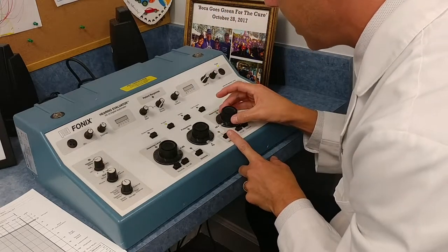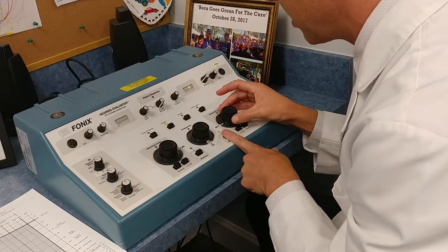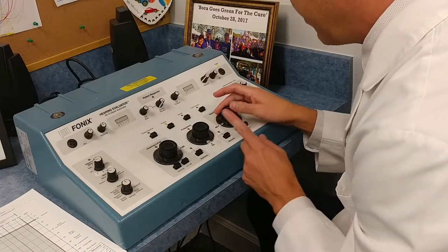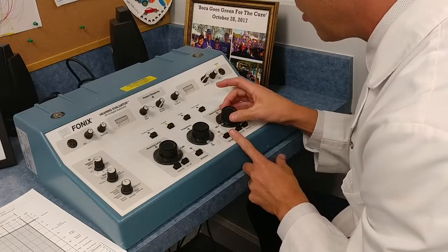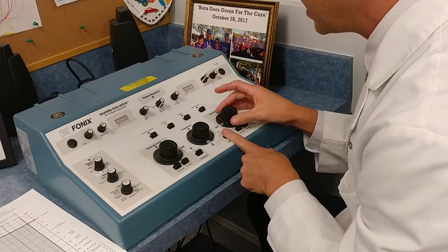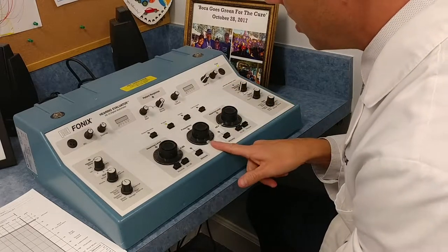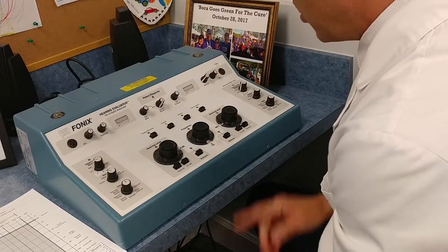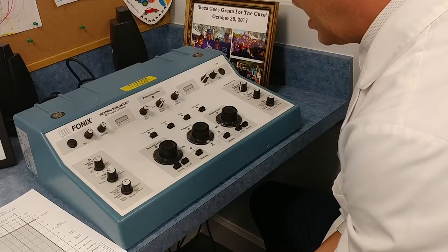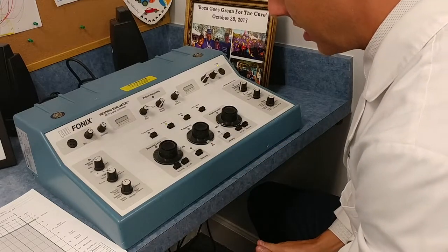If they do not hear it, I'm going to go up 5 decibels and present my stimulus again. I will always go up 5 — this way I never injure the patient with a loud sound. If I present the stimulus and they hear it, I'm going to go down 10. Up 5, down 10 is the rule. I'm also going to test all octaves and interoctaves because it gives me better test-retest reliability. You don't have to do interoctaves unless there is a gap of 20 between octaves; however, IHS also says you shouldn't cut corners.